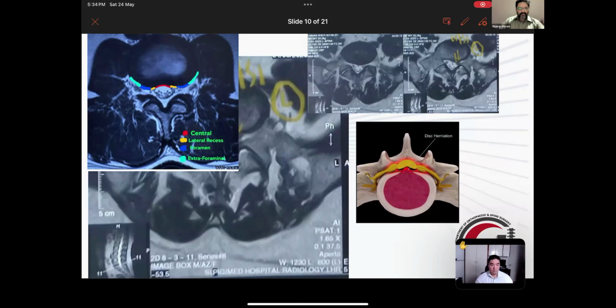Yeah, even in biportal, what we used to do is that when we stop surgery, we keep the cannula in and let the fluid come out, and I stop the irrigation to see any active bleeding point.